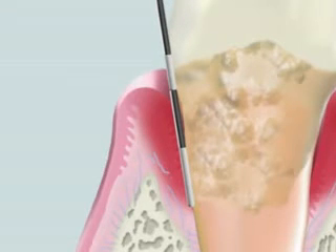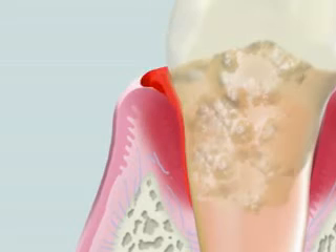First, probing is conducted to measure the pocket depths. Simultaneously, root morphology and conditions of calculus formation should be examined. Bleeding on probing is noted, and calculus and dental biofilm have accumulated on the two surfaces.